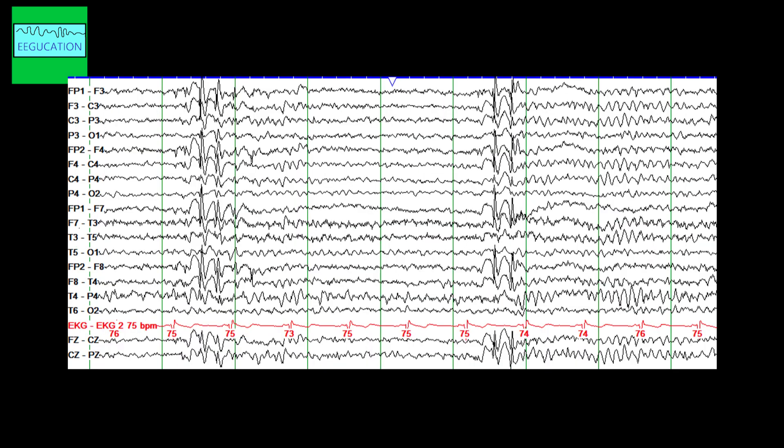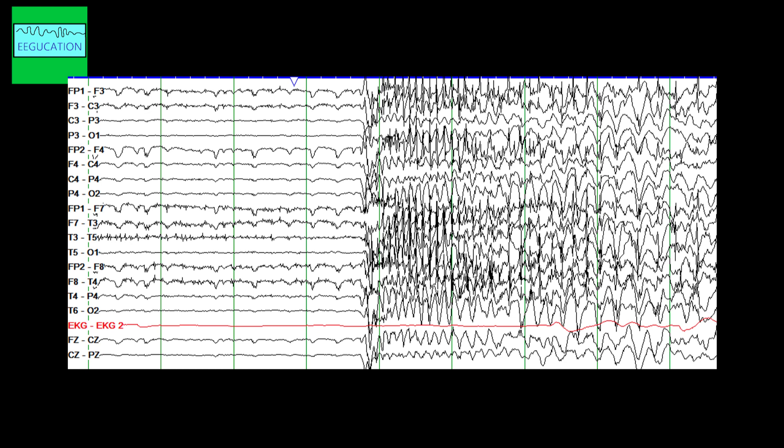This is another EEG from a different patient: routine EEG and sleep-deprived EEG had not shown any abnormality, but on ambulatory EEG we were able to see generalized spike-and-wave, which helped in management by choosing the right medications. Yet another example is a patient experiencing many falls and bruises at home who lived by himself — on ambulatory EEG I was able to capture multiple seizures, and the patient was started on appropriate medications.